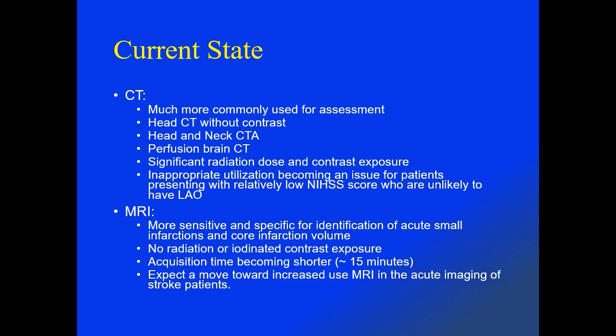MRI is more sensitive and specific for identification of acute small infarctions and core infarction volume. No radiation or iodinated contrast exposure is needed. Acquisition time is becoming shorter. I expect a move toward increased use of MRI in the acute imaging of stroke patients.